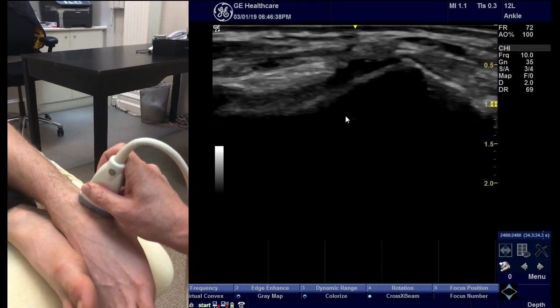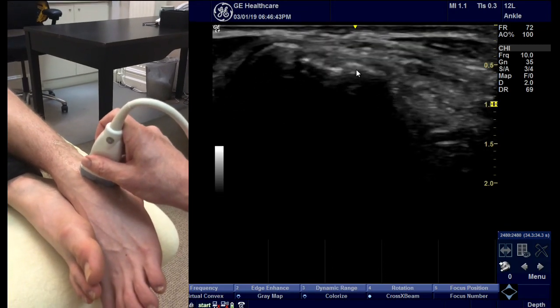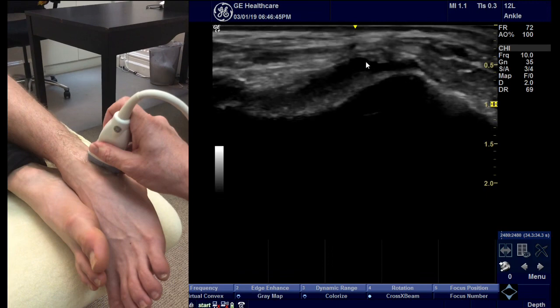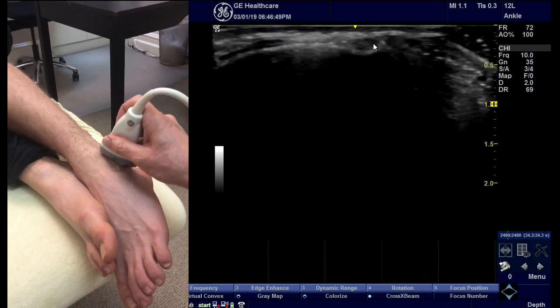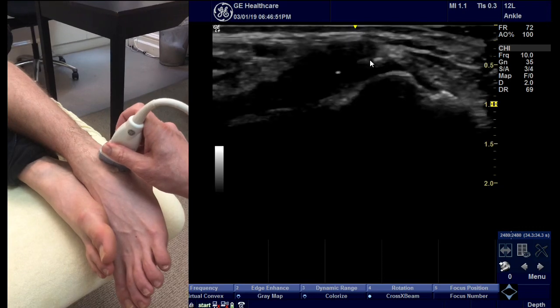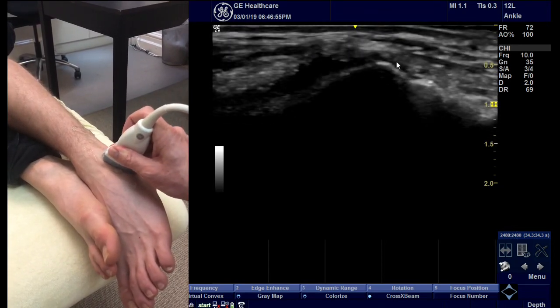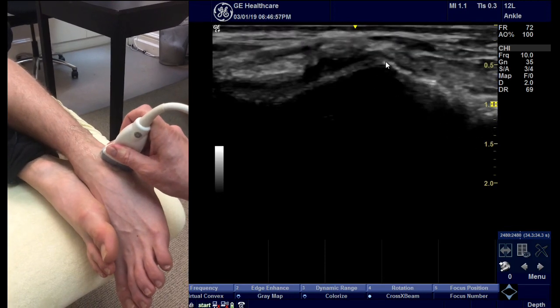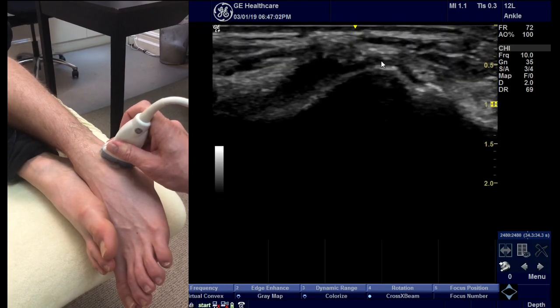I then turn into short axis. This is the ligament here, and I scan all the way onto its insertion onto the talus, and then back up in short axis onto its insertion onto the fibula. If you look really carefully, you will see some smaller fibres inferior to this, and this is an accessory ligament that crosses at a slightly different angle.